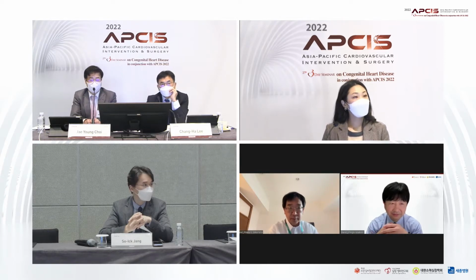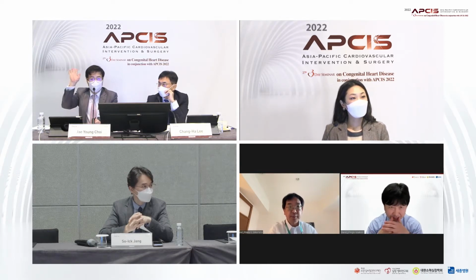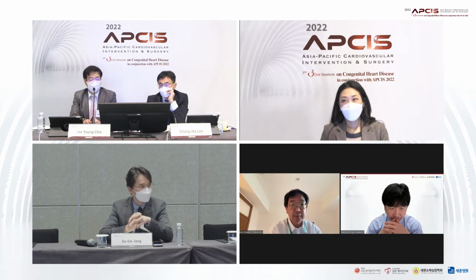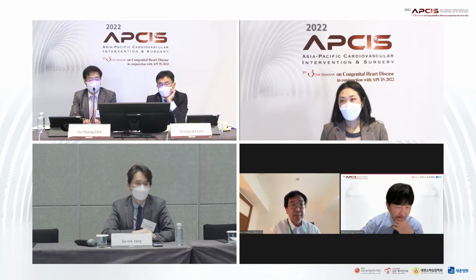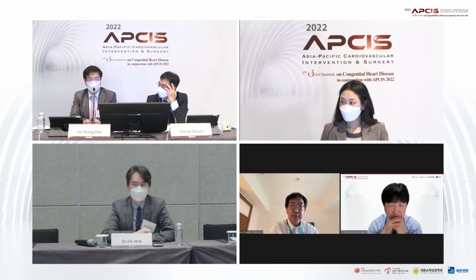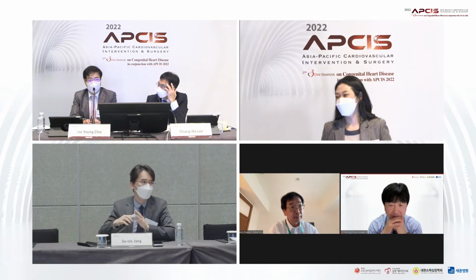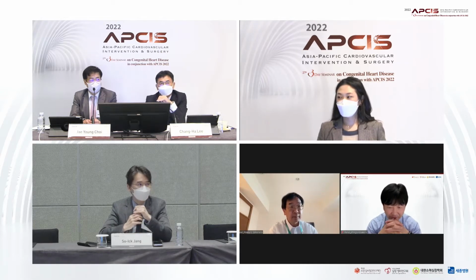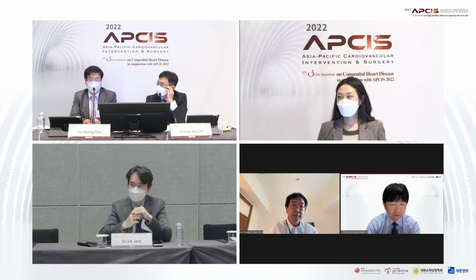Do you have any? We couldn't hear. Hello. Mic on, please. Just to ask, when you did the balloon dilation, what was the pressure? Usually we dilate any balloon to the rated burst pressure, so I think 8 ATM or something like that.